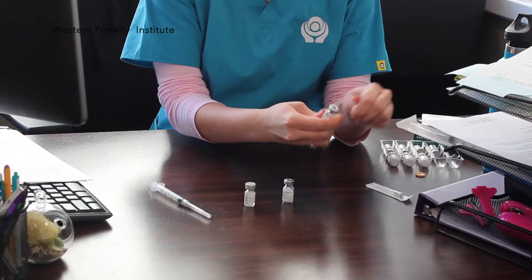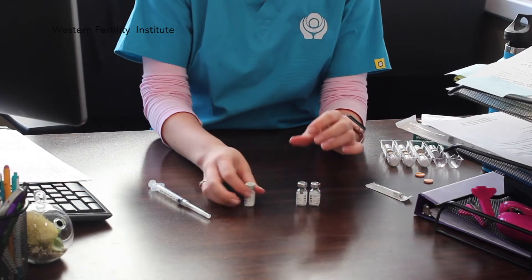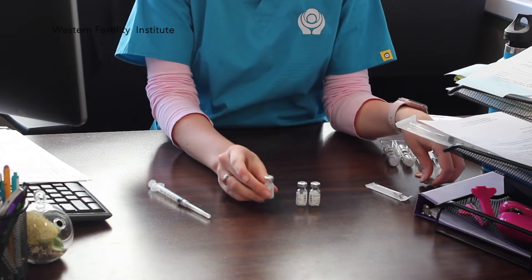Let's say your dose is 2. You'll then take 2 powders of Menopur and put them to the side, along with 1 of the sodium chloride. You can take off the top on the 2 powders and take off the top on the fluid.